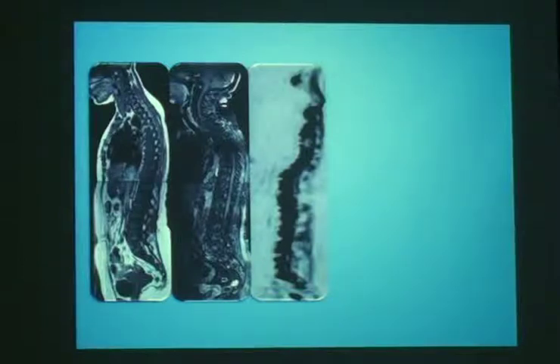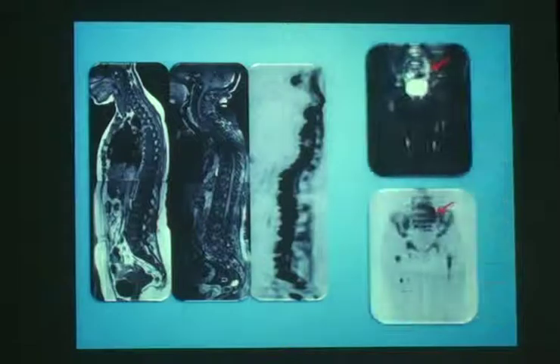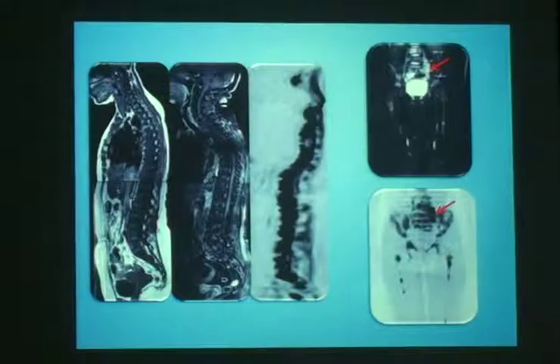But then again, a bone scan was more superior in this case at this setting. We can see there was a soft tissue deposit here, and there were more lesions detected as regards the femoral. So we can say that both studies completed each other.